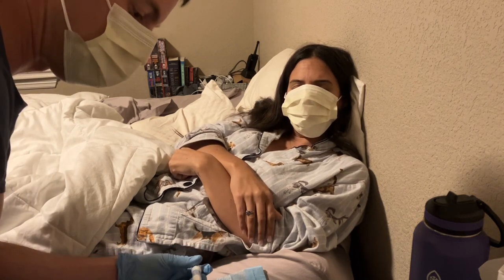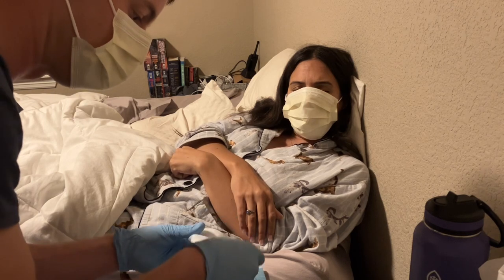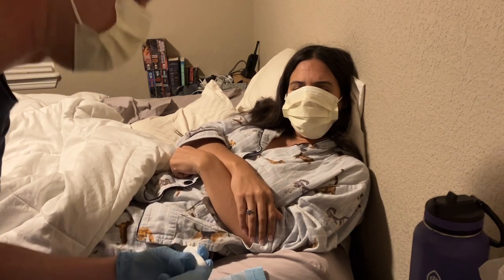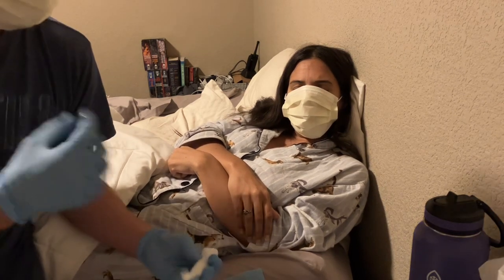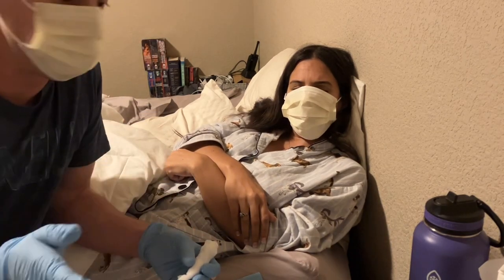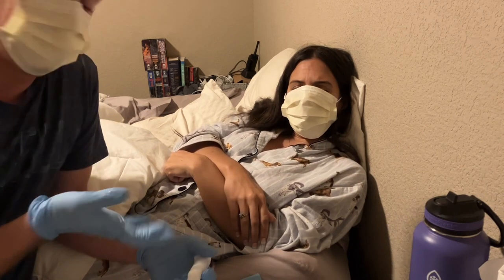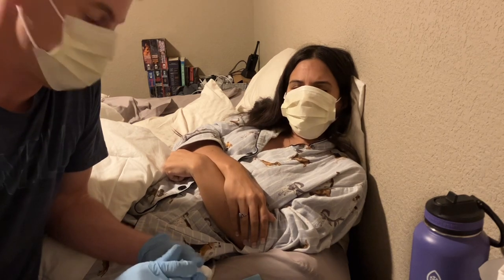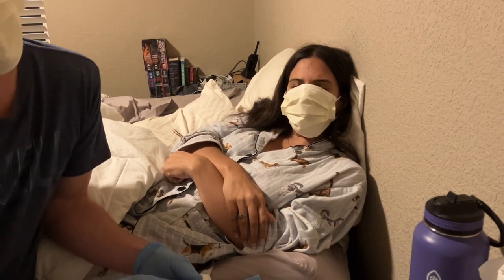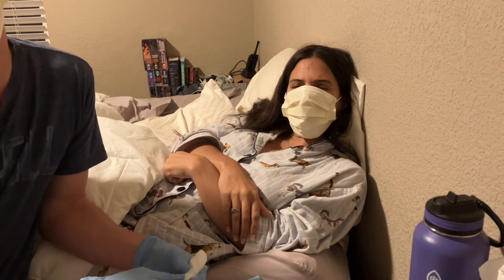We do this when Bella's in bed, which is great. The mask in this sense is literally just — now I'm going to soak the catheter completely in bleach and let it soak for an additional minute. So it's wipe off and work around, and then wrap it up and let it soak. The mask is so that vapors or whatever's in our mouth don't get near the opening. You'll see how quick the connection is — we literally hold them next to each other, open, open, connect. It's open for less than a second. We hold our breath too, to be perfectly honest. There have been a couple of times I forgot to wear a mask and I just held my breath because I didn't grab it in time. We try to be as safe as we can so that we don't get infections.